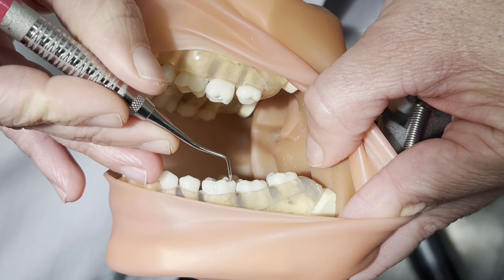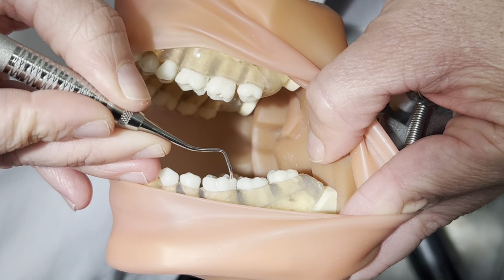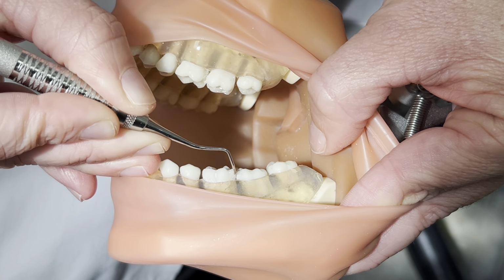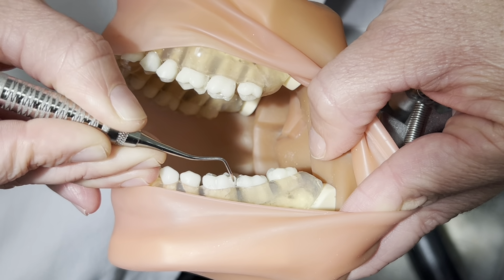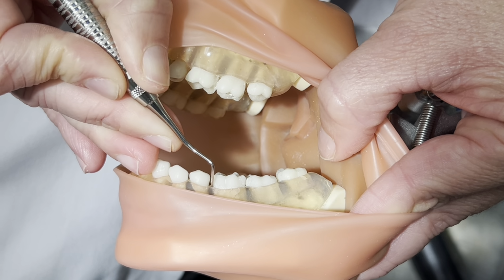And next is a vertical stroke. Vertical strokes are applied on the distal and the mesial of this tooth. So starting with the distal, vertical stroke, and the mesial, vertical stroke.